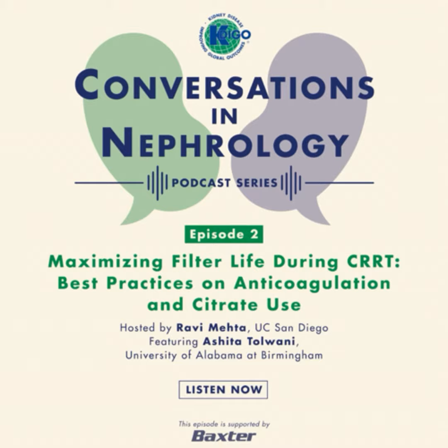And finally, one last thing I just want to say is that patients with severe liver failure or lactic acidosis may have difficulty in metabolizing citrate. So you need to be able to recognize citrate accumulation and how to correct for it. Again, RCA has been used safely in patients with advanced liver disease and with lactic acidosis. And these metabolic complications can be avoided if you use really strict protocols, appropriate training, and of course, safer citrate solutions and integrated citrate software if you have that availability.